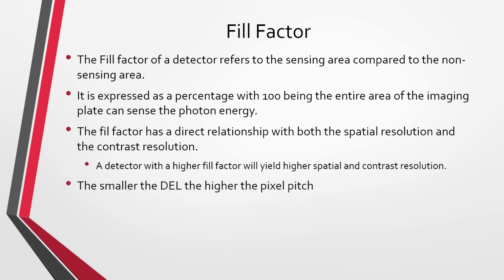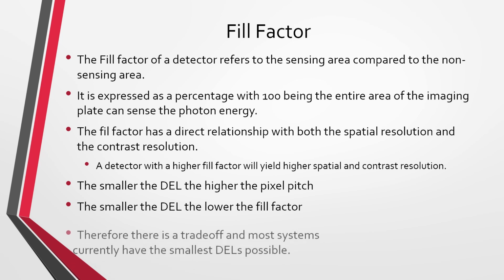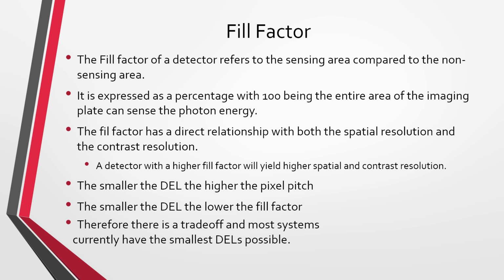The smaller the del, the higher the pixel pitch of the image will be. We want a high pixel pitch. But the smaller the del, the lower the fill factor will be. Therefore, there is a trade-off, and most systems currently have the smallest dels possible.